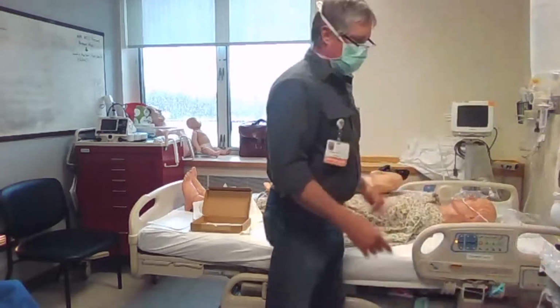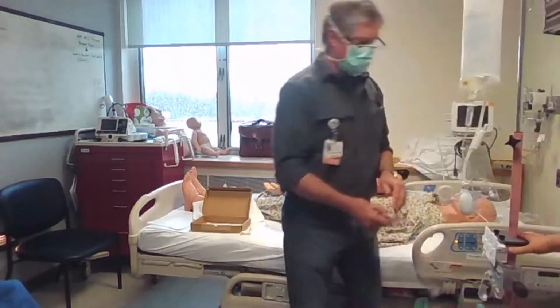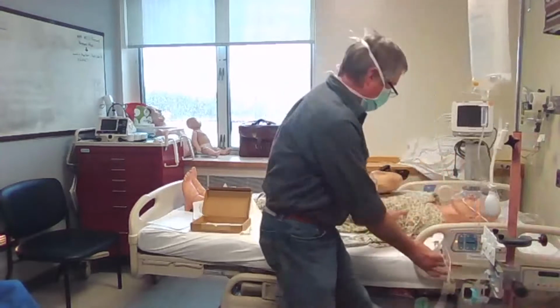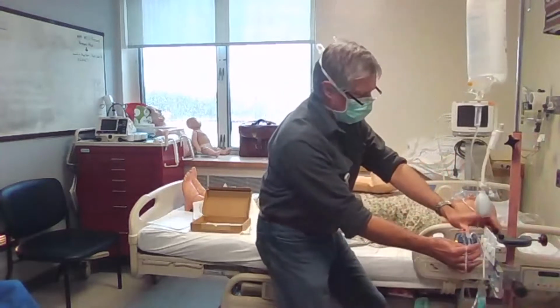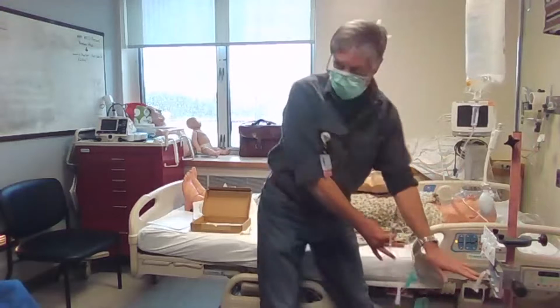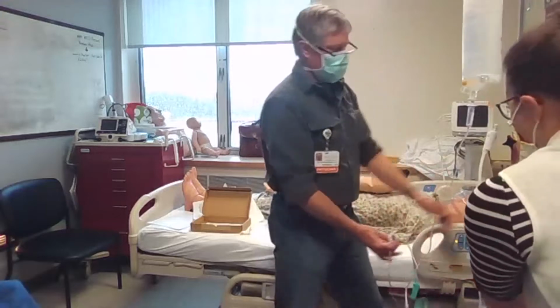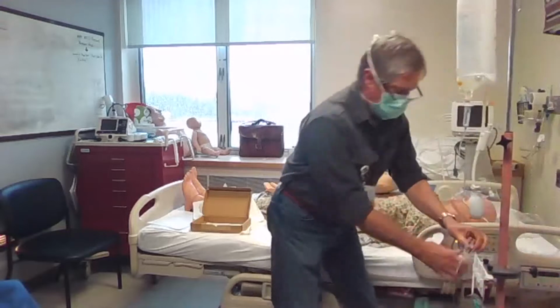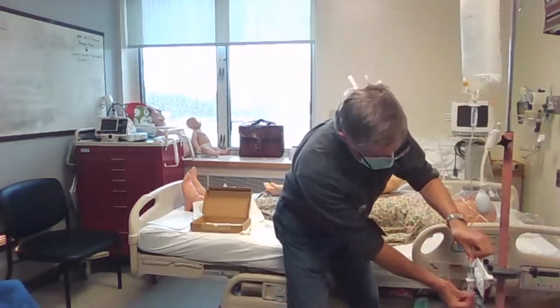Another way to do it is this. In the OR, we'll use this a lot. So you set it up, you zero it, you make it all level. This would have to actually be at the level of the phlebostatic axis. I got a non-broken one. And you just slide it in here like that.